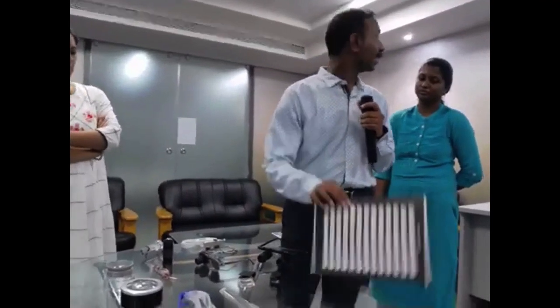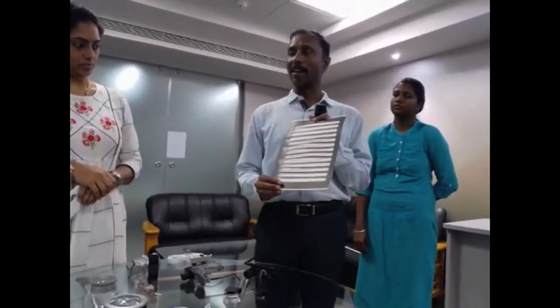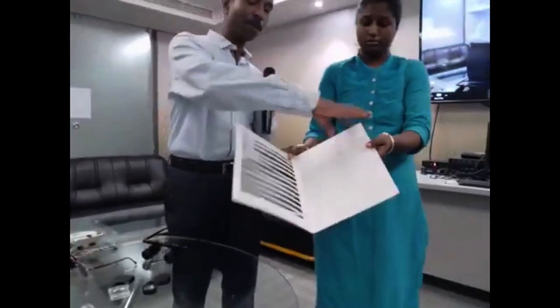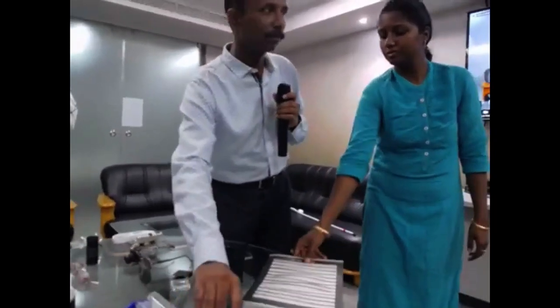This is the letter writer. It is not a very difficult tool if you see. Nothing other than just black lines to help the patient differentiate. You can place a normal sheet and take out that sheet. This is the signature guide. The patient can place it on the notebook or the checkbook wherever required and ensure that his signature is happening at the proper place. It improves the contrast.